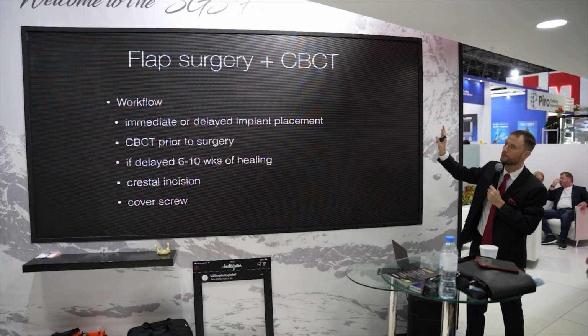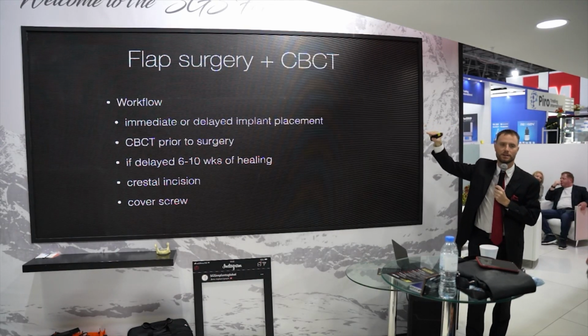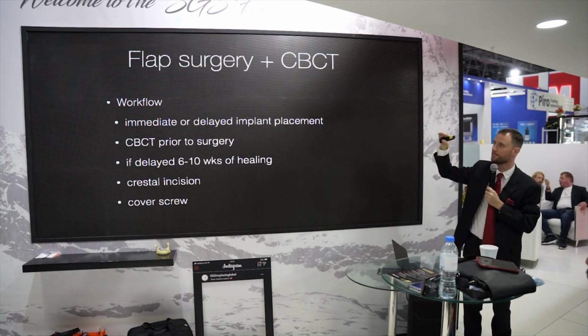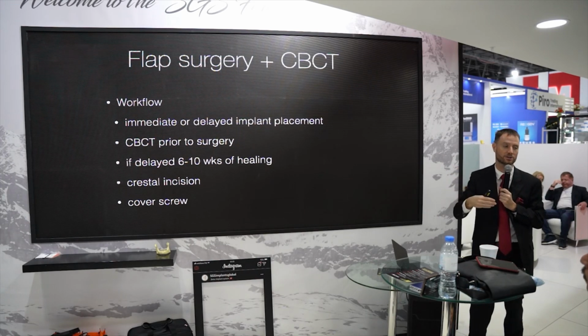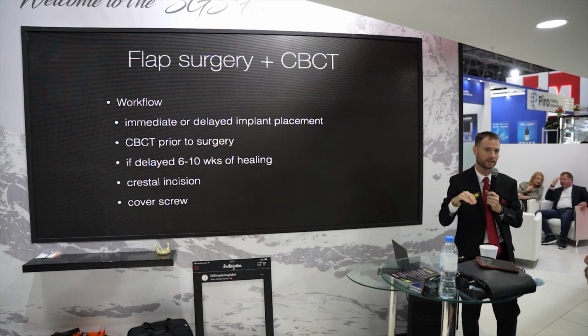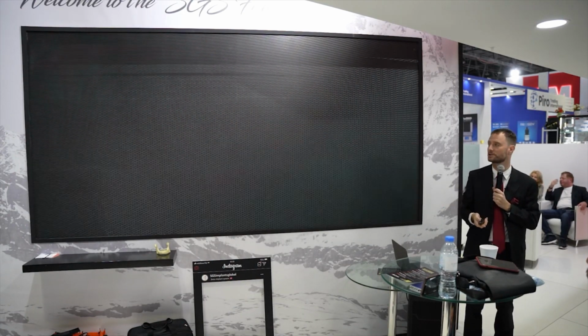Anyhow, when you go for the flap surgery, we have an easy workflow. Depending on immediate or delayed implant placement, we do a CBCT prior to surgery. Usually, if it's not immediate implant placement, you have to wait 6 to 10 weeks after extraction before placing the implants. I myself prefer the crestal incision, very minimally invasive, and then just cover it up with a cover screw and do the sutures.